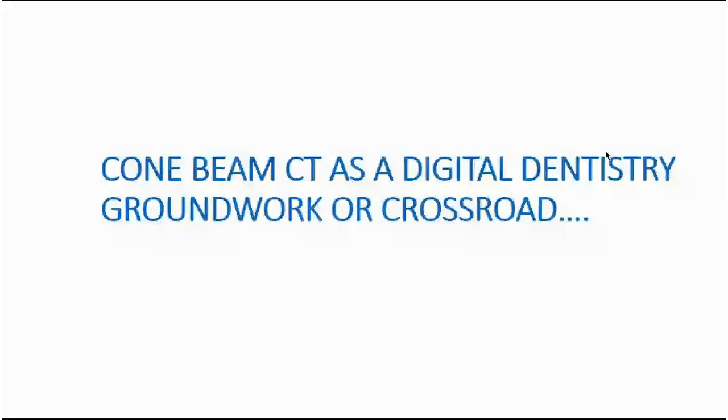And we had the opportunity to talk about cone beam as a crossroad to our groundwork to the digital dentistry. Digital dentistry in coming years will be reality, our reality, and I am sure that it will be.